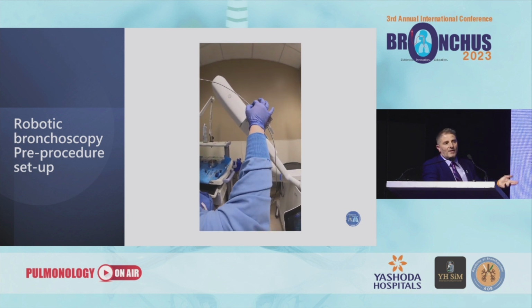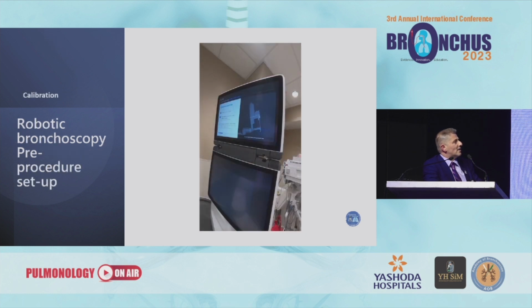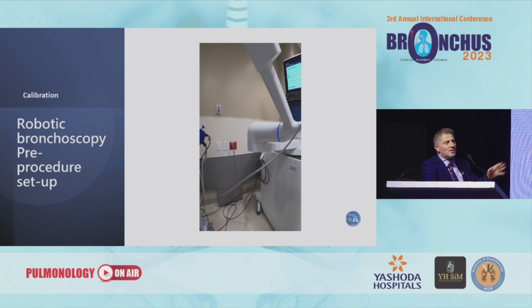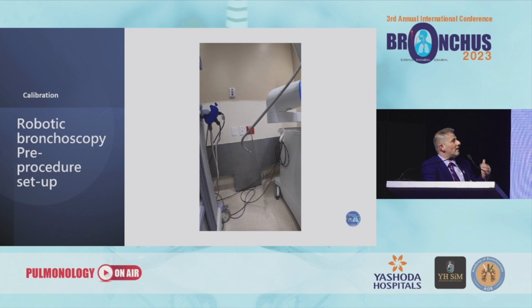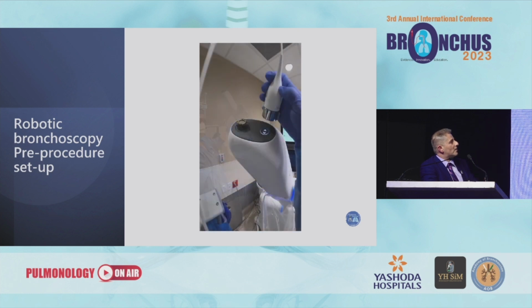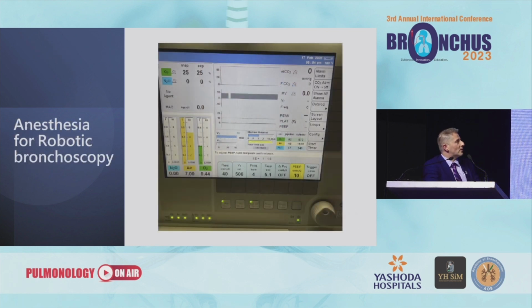Those have a 5-time life use. So you use them for 5 cases usually, and after that they're not usable. Of course, there's a cleaning of those specific connection points, and then the catheter will do the calibration, which is a very important part of the procedure because you want to make sure that this is happening prior to establishing the drive that gives you the 3D sensing shapes created by that catheter. And after that, everything will be ready to proceed, and connecting the vision probe at the end. This setup is already done prior to the procedure, of course.